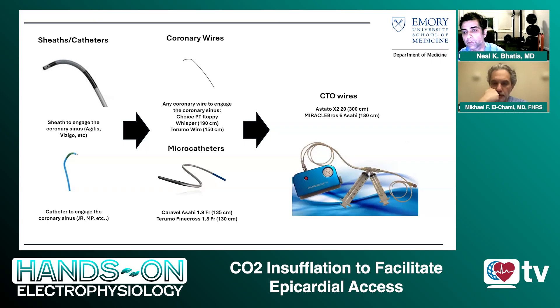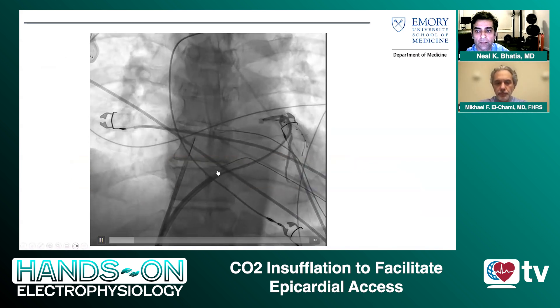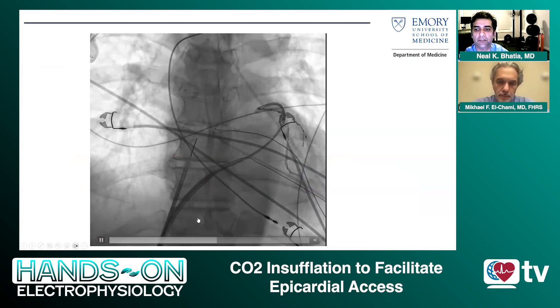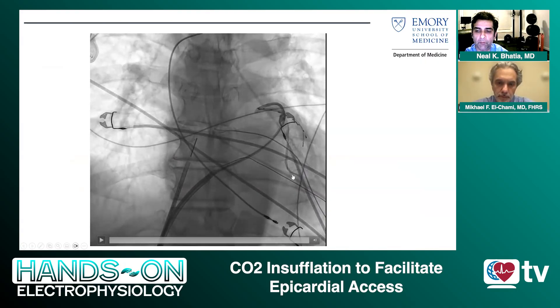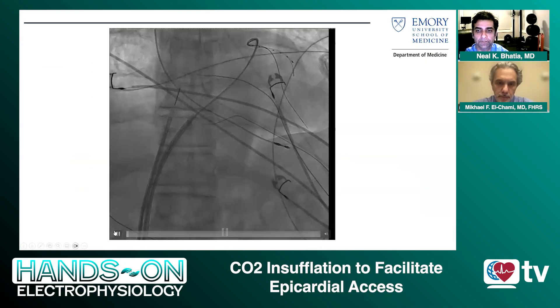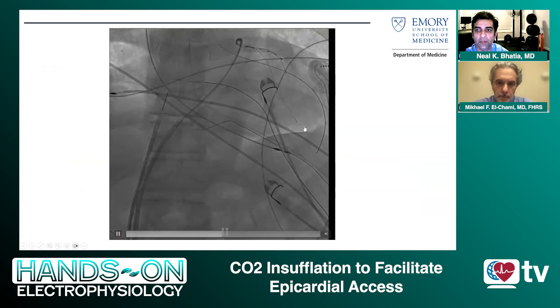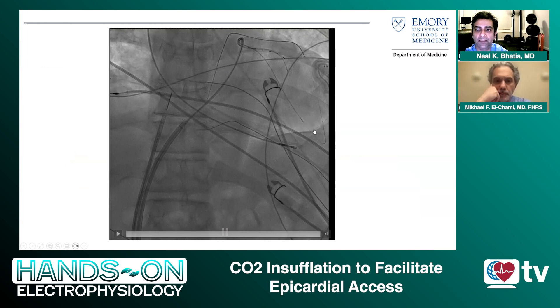These are very small microcatheters, like 1.8 or 1.9 French. You put the wire all the way to the end of the CS, then exchange for a CTO wire, and you can perforate through the vein into the pericardial space, advance the microcatheter into the pericardium, and inject CO2 that way. Here you can see we've gained access into the coronary sinus with our microcatheter at a very small branch. I advance the microcatheter further out, insert the CTO wire, and easily get into the pericardial space. Once I gain access, I slightly advance the microcatheter with a little clockwise motion to get into the pericardium.